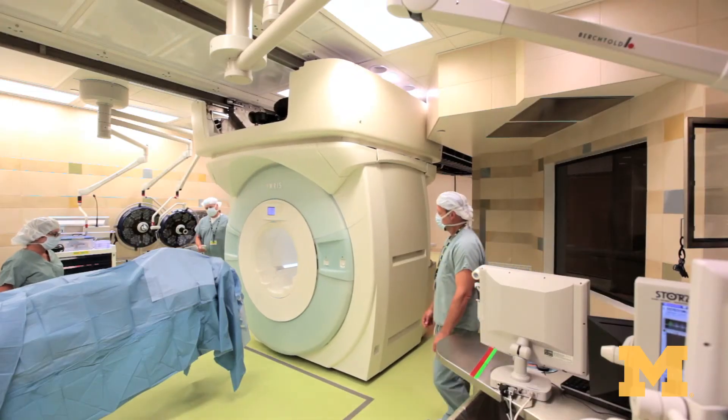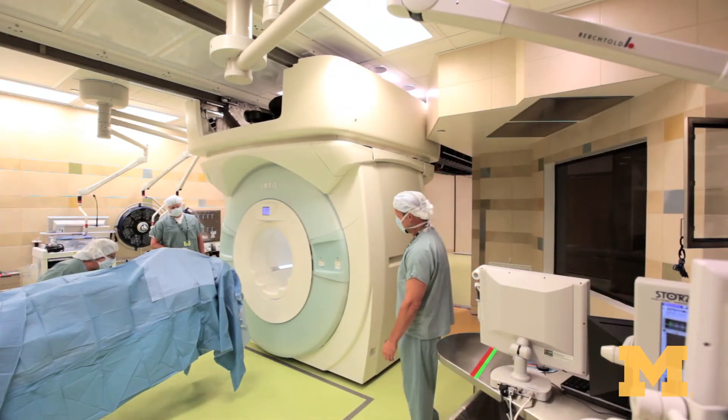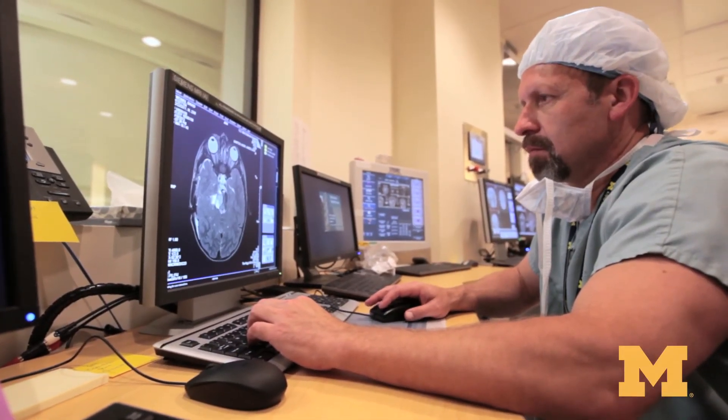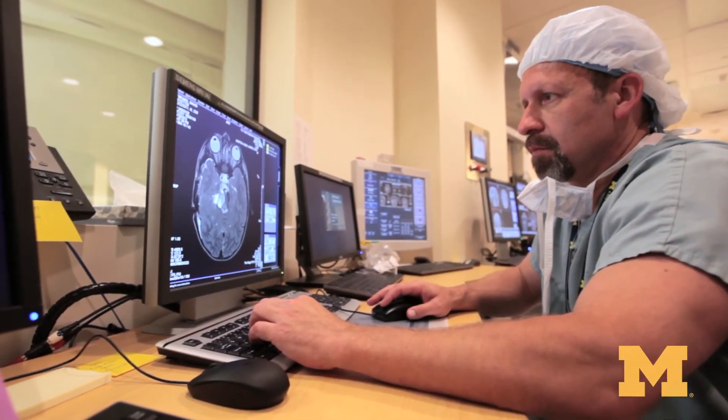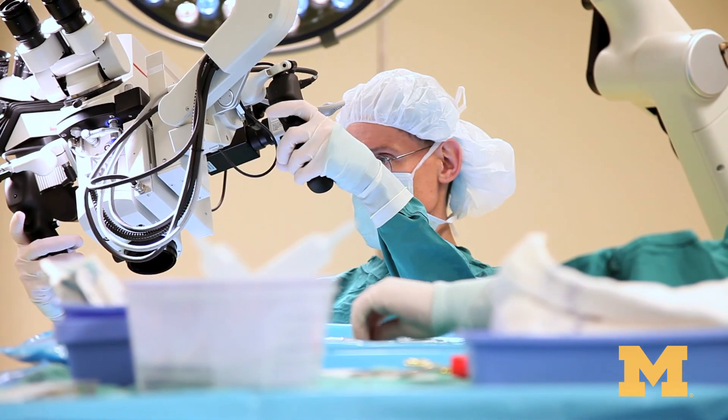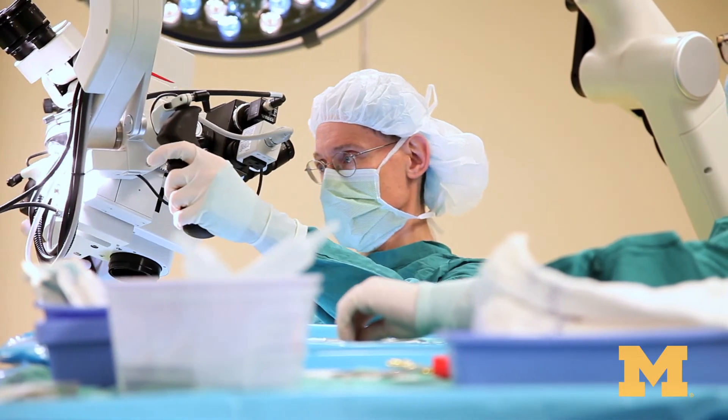The intraoperative MR scanner is an invaluable tool in looking after patients with neurological disorders, and we can do things we really couldn't do before. But it is only one part of a much larger picture. At University of Michigan, we have a wide team that involves neuro-oncologists, neuroradiologists, dedicated anesthesiologists, and nursing staff — all experts in taking care of very specific neurosurgical problems. Functioning in that team environment is critical to our success.